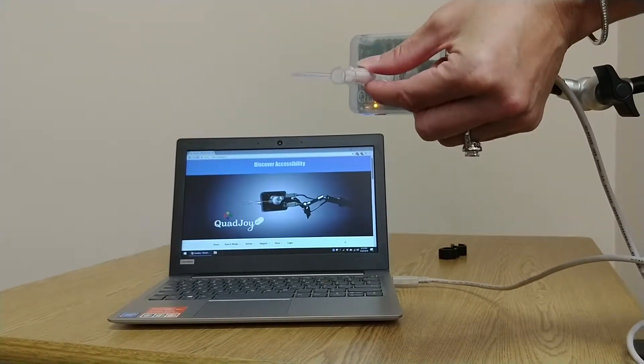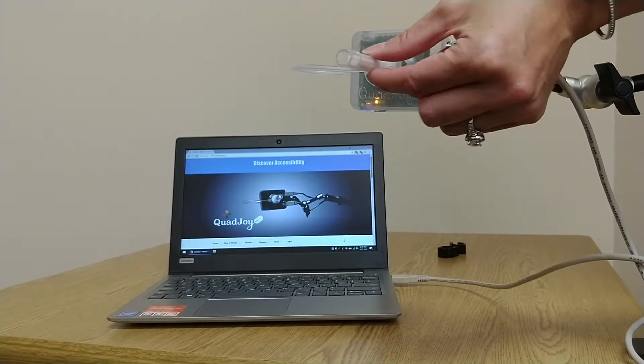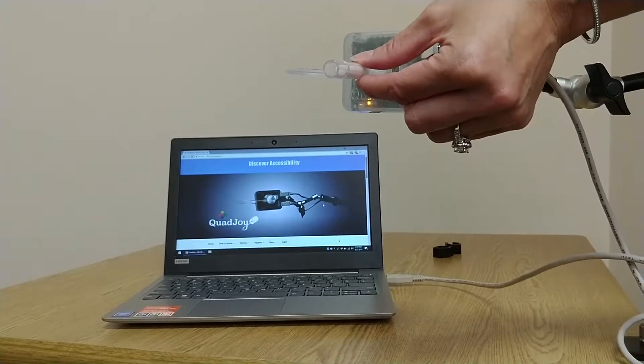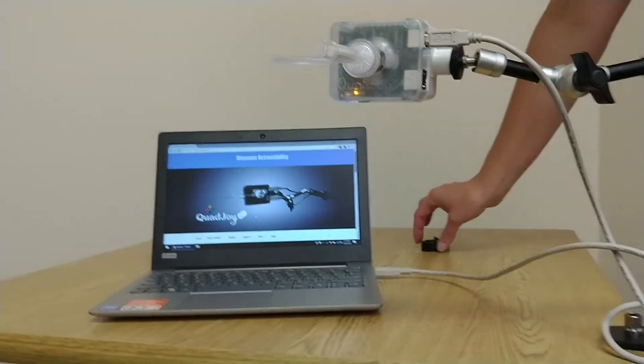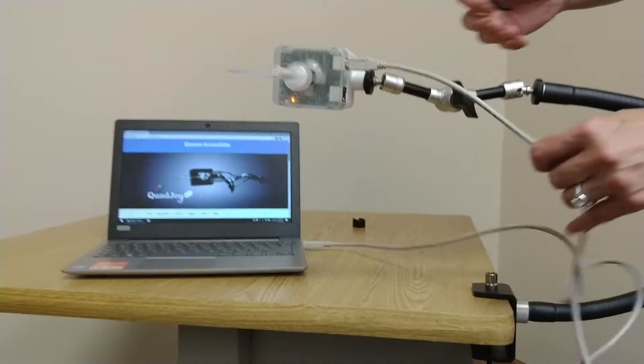In the event something is not working, try unplugging one of the ends of the cable and replugging it in to correct the problem. Now you can take your cable clips and attach them to the flex arm to secure the USB cable.